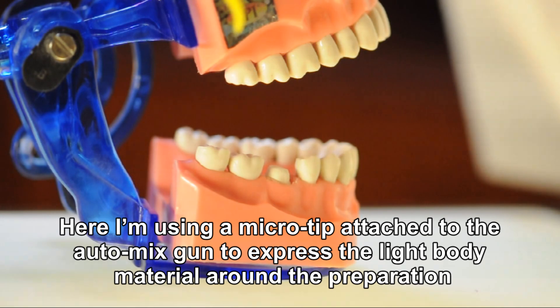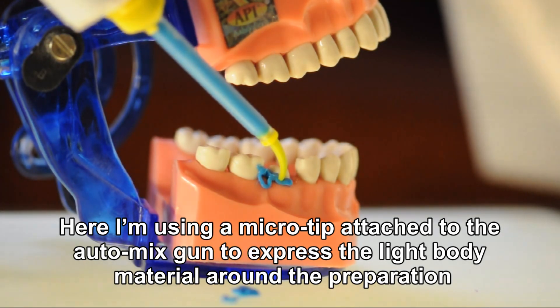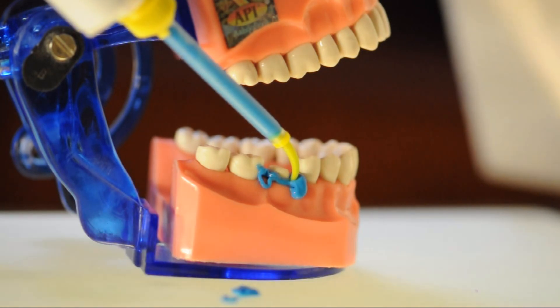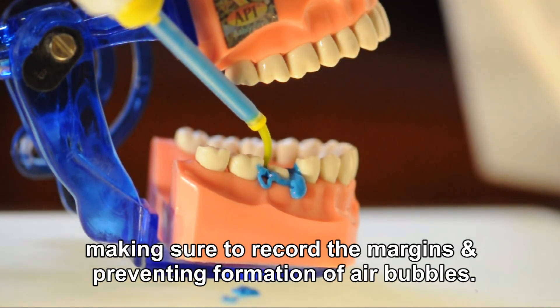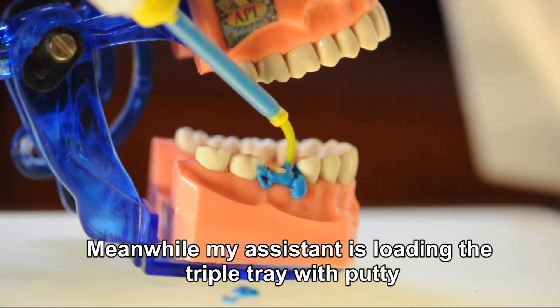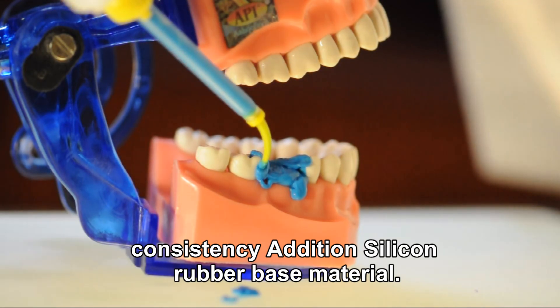Here a micro tip attached to the automix gun is used to express the light body material around the preparation, making sure to record the margins and prevent formation of air bubbles. Meanwhile, the assistant is loading the triple tray with putty consistency addition silicone rubber base material.